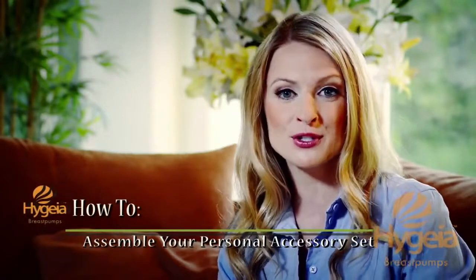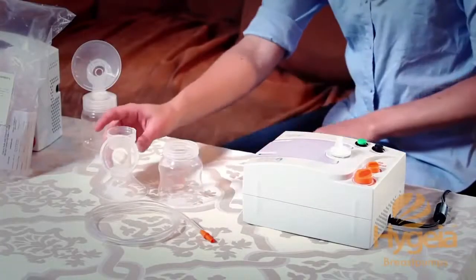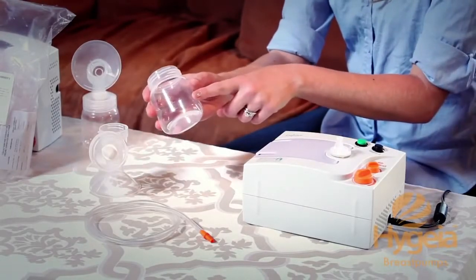Hi there, I'm Marianne. Today we are going to go over how to assemble your personal accessory set. Your set will come in a bag that looks similar to this, but may not have the same contents. In order to pump, you will need tubing, flanges, valves, and storage containers. When you put it all together, it will look just like this.